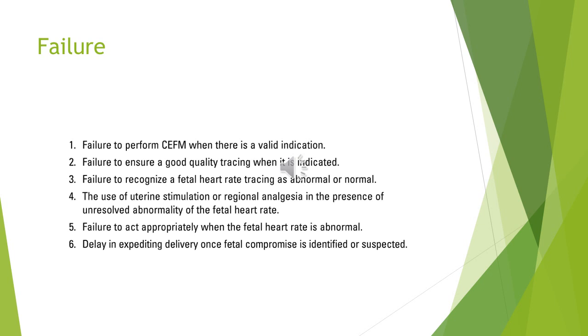Failure to recognize the fetal heart rate abnormality. So you recognize that in this case CTG is indicated, you ensure you have good quality, but you didn't have the proper training for CTG interpretation. So you didn't know what the CTG means, or you know what the CTG is, but you don't know what to do. So you fail to act appropriately when the fetal heart rate is abnormal.